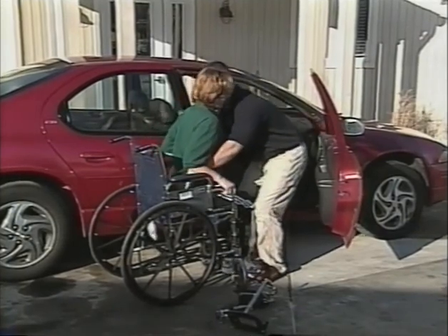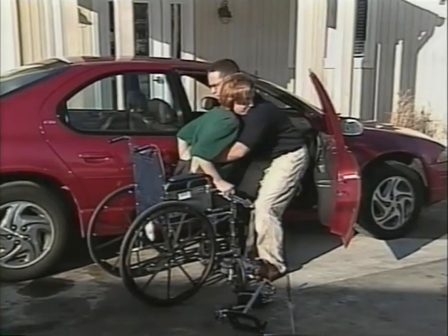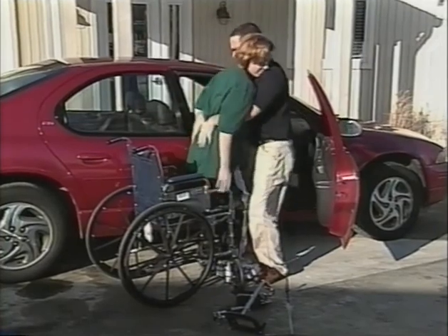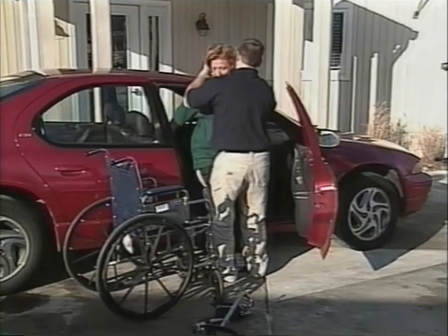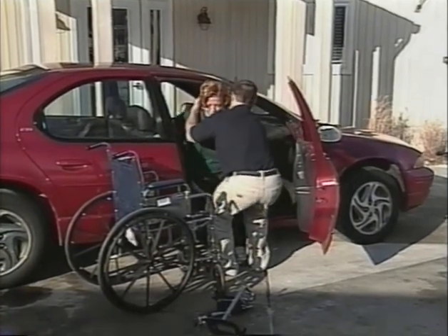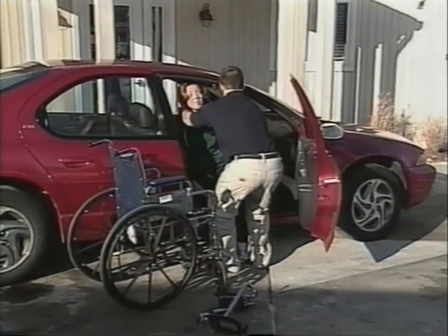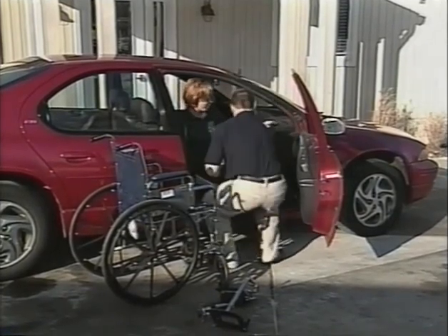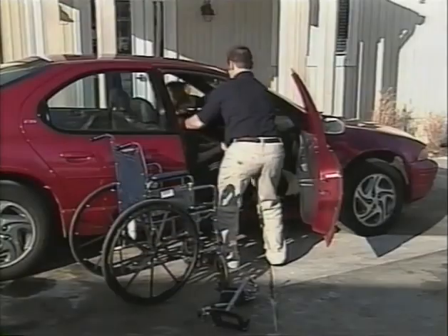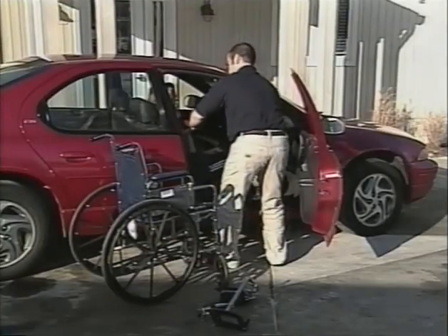Help the client to the standing position. Have the client pivot so the back of their legs are against the seat. Slowly lower the person into a sitting position. Lift each leg into the car. To return the client to the wheelchair, reverse the procedure.